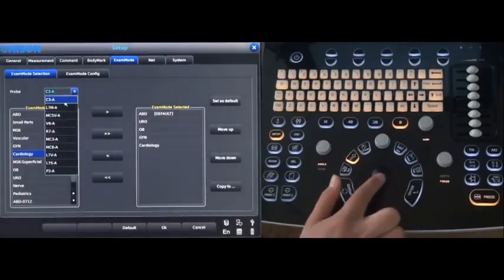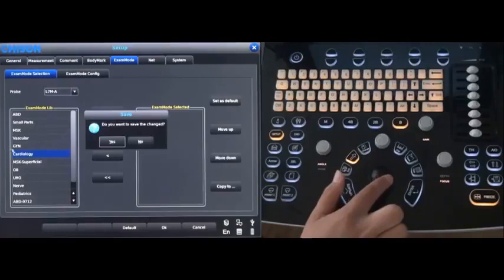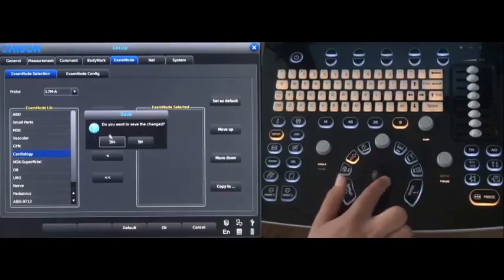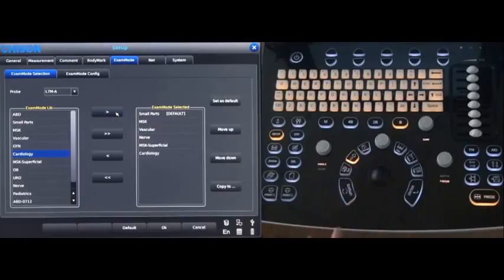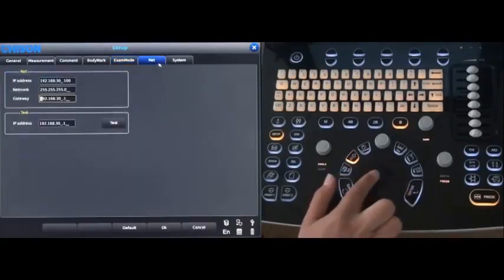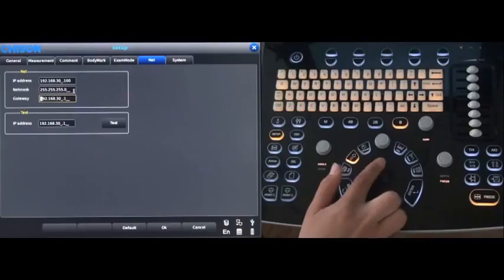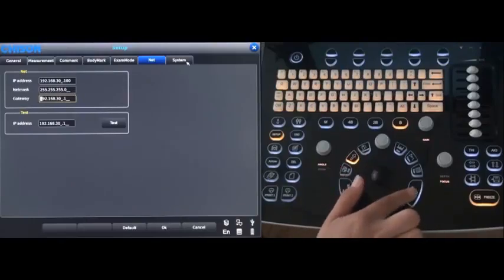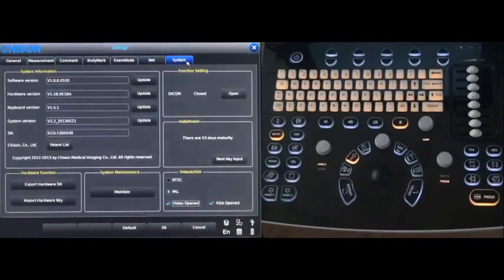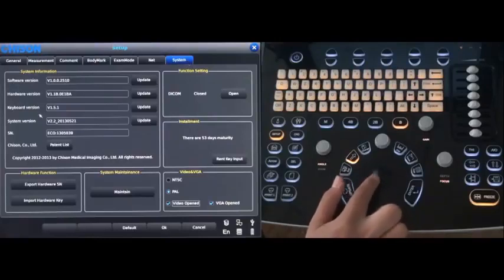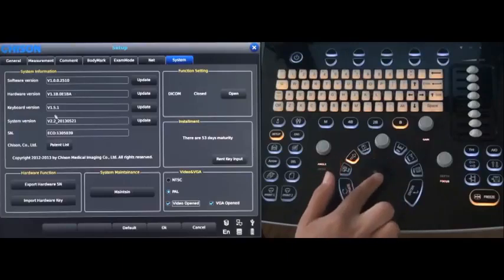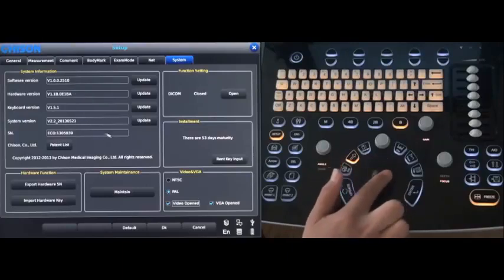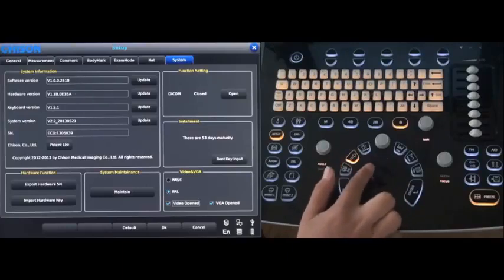Choose the probe first. Then go to net for the network. Then go to system. All the system information is here. Also if you need to connect to the video printer and VGA, you can choose the video and VGA part.